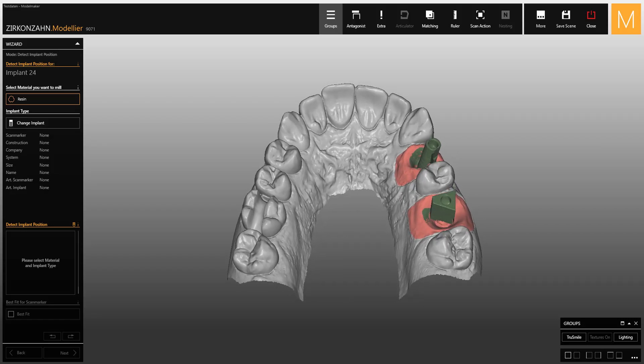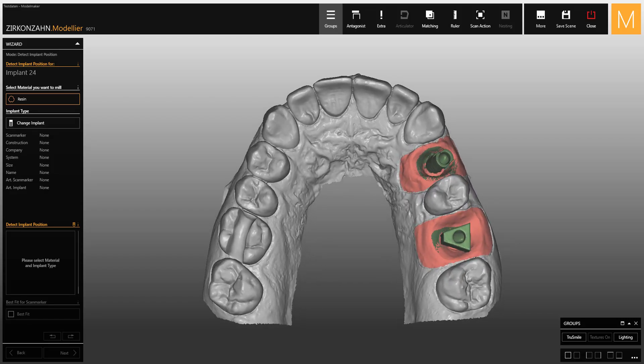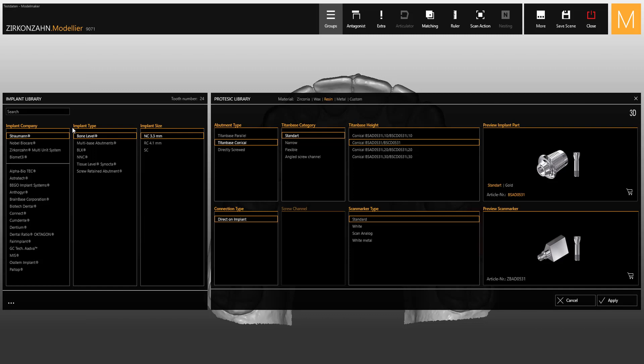In this video, we will show you how to use the implant selection window in the ZirconZen Modeler software. In the wizard, click on Change Implant. The opened implant selection window is divided into Implant and Prosthetics Library.